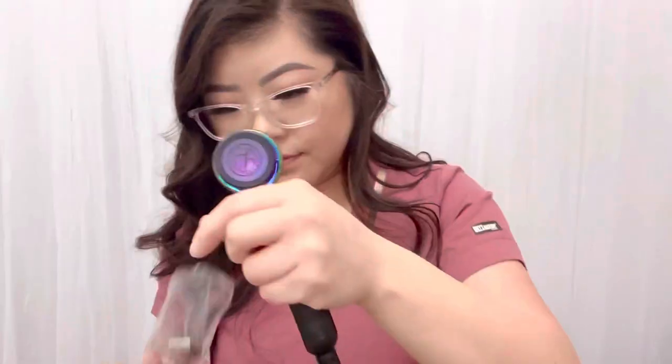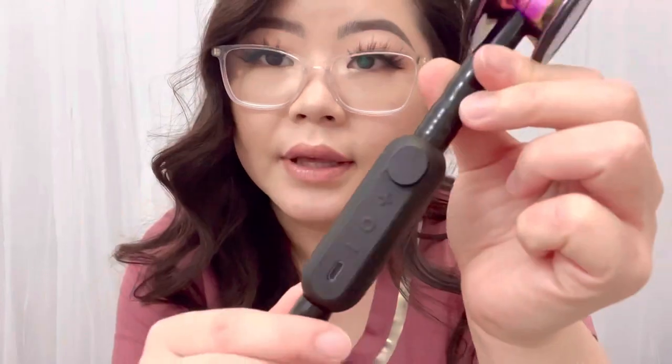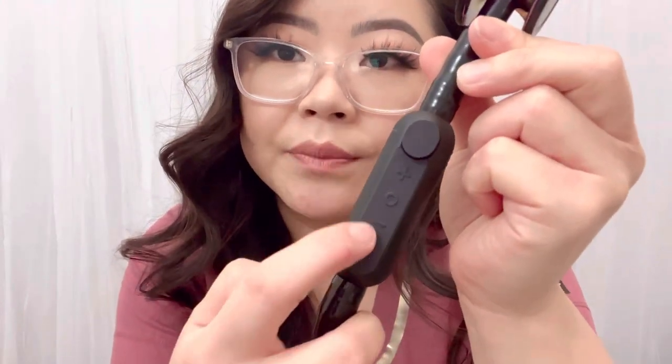If you look at the stethoscope, it has a charging port that you can charge, and they have a little charging wire for you. It has a volume button. The way you use it is you push this button and make sure you see the light here — that's when the core part is working and you're able to record the sounds. However, I haven't downloaded the core app yet.